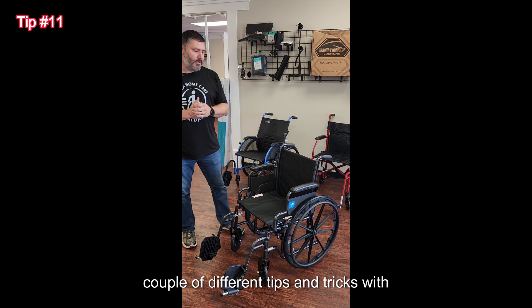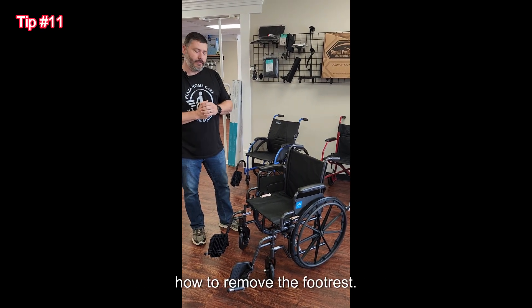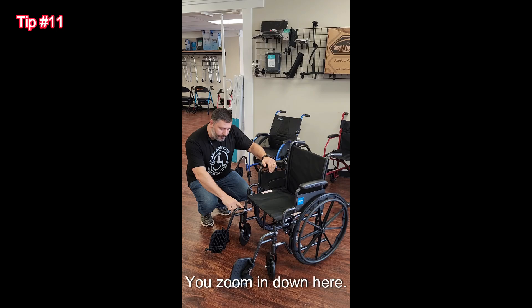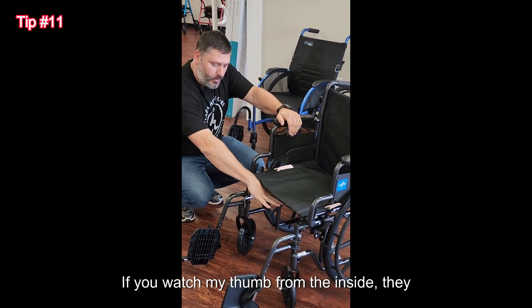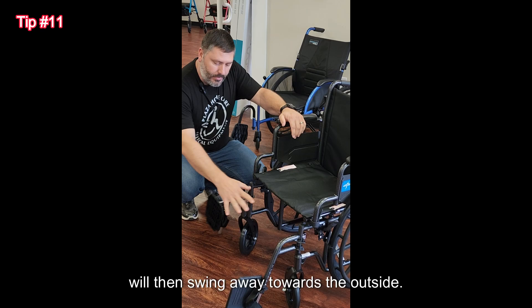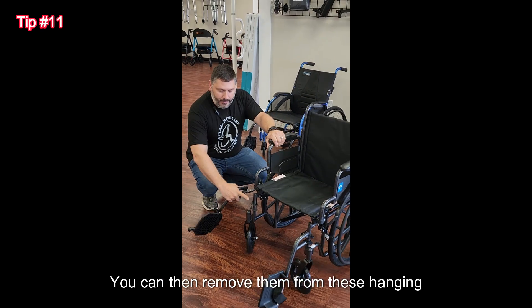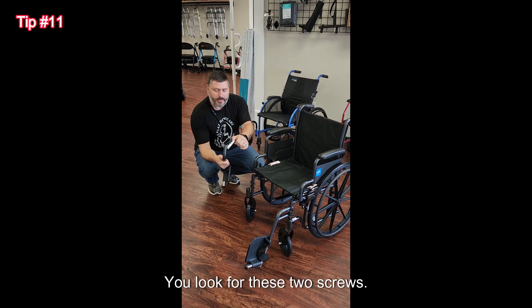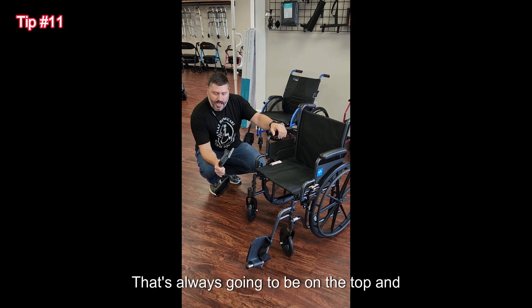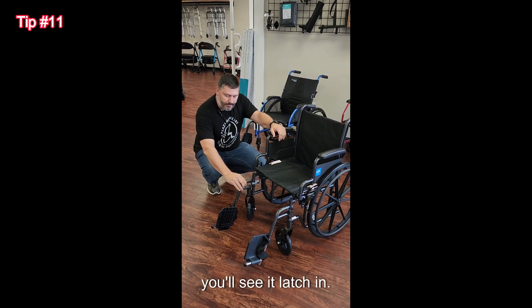Let's look at wheelchairs. First, I'm going to show you how to remove the footrest. Most footrests are going to have a latch here — if you watch my thumb, you can pull from the inside and they will swing away towards the outside. You can then remove them from the hanging pins on the side. Quick trick: look for these two screws — that is your latch, and it's always going to be on the top and the inside. So if you hang back on the pins and spin it around, you'll see it latch in.